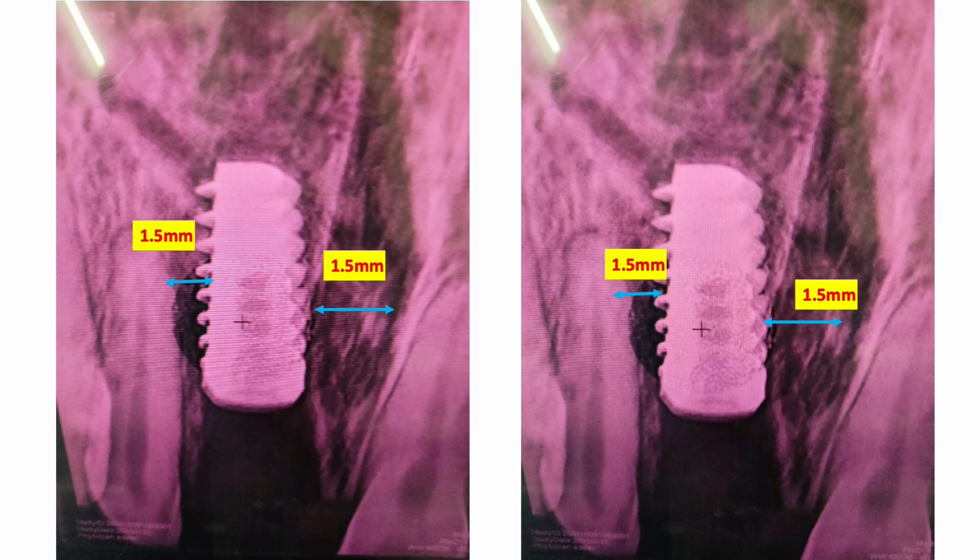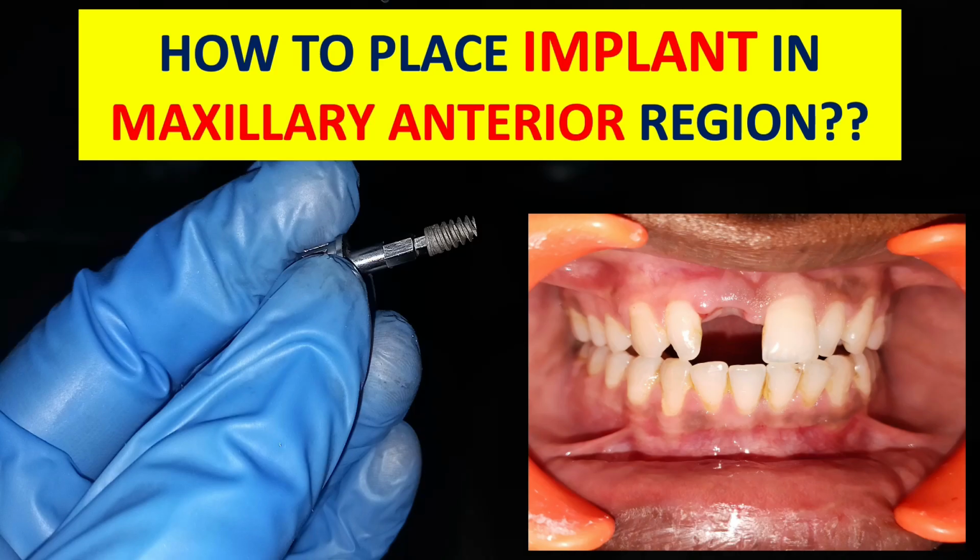I hope this video is helpful for you to understand how to place an implant in the maxillary anterior region and how to do treatment planning before placing the implant.